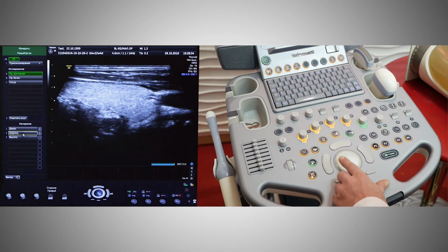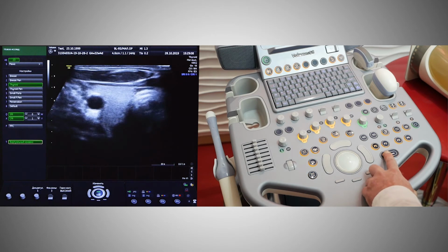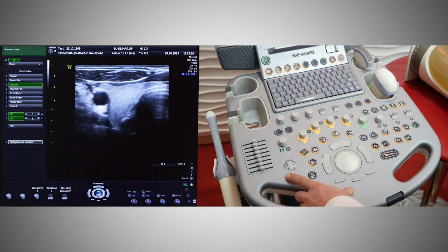And we turn on the caliper in order to measure the size of the thyroid gland. At the bottom of the screen, we see the volume of the right thyroid gland. To return to the linear scan, we drag to the virtual convex and switch to a simple linear scan.